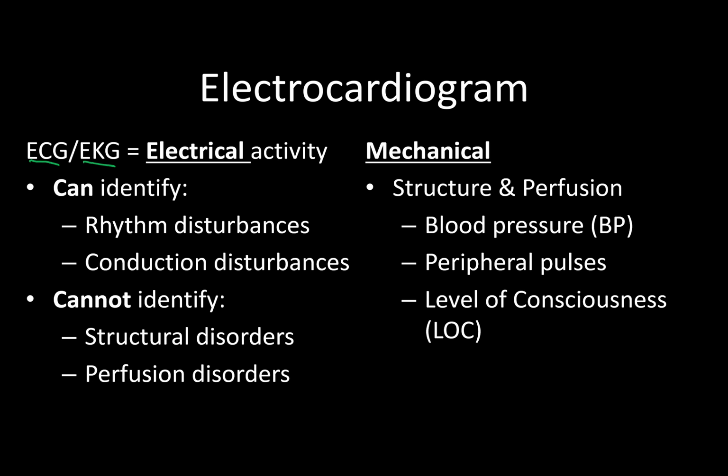All that you can do with an EKG is identify rhythm disturbances and conduction disturbances. You cannot identify if there's a specific structural problem or a perfusion issue, because those are mechanical. Structure and perfusion, that's your blood pressure, your pulses, and even your patient's level of consciousness.